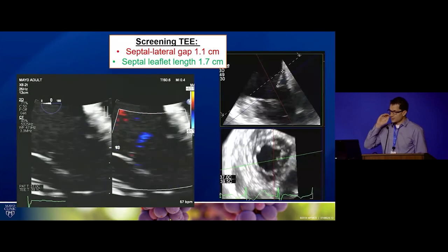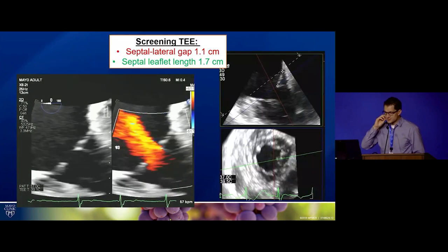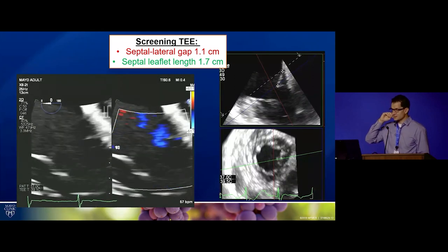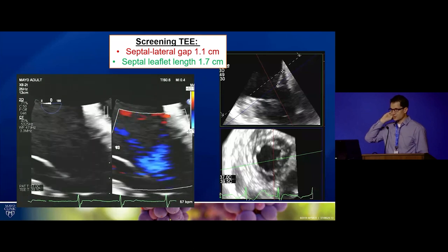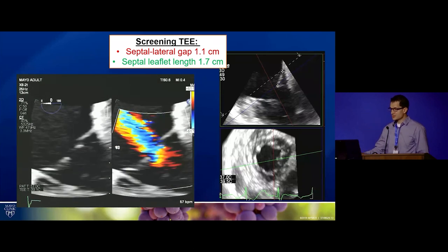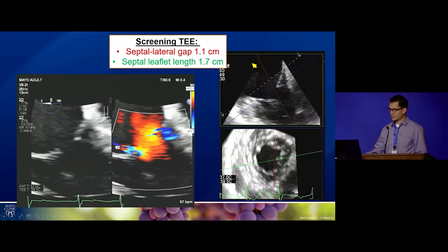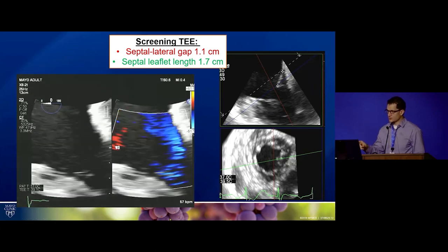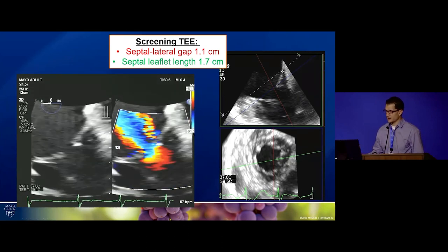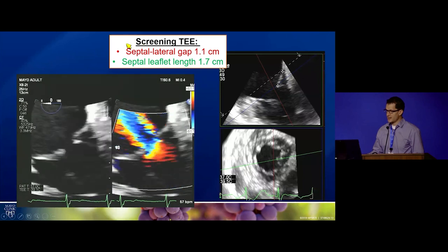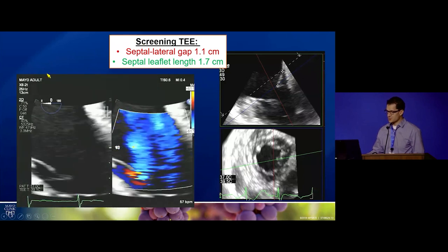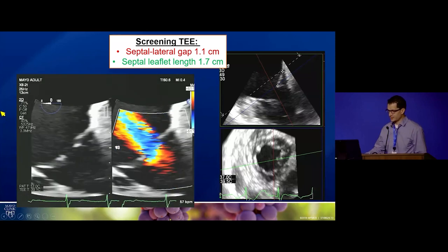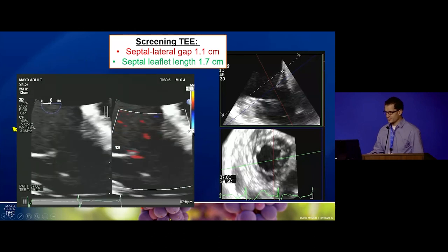This case illustrates the thought process for selecting patients for transcatheter tricuspid repair. One key consideration is anatomy. There were a couple of echo features that concerned us about edge-to-edge repair, one of which was the large gap. Sorin performed a transesophageal echo using the deep esophageal image — pushing the transducer deeper into the esophagus brings you closer to the tricuspid valve.